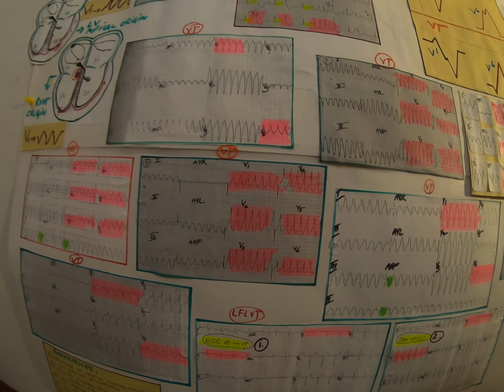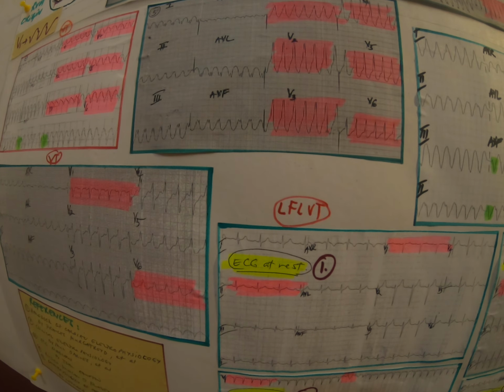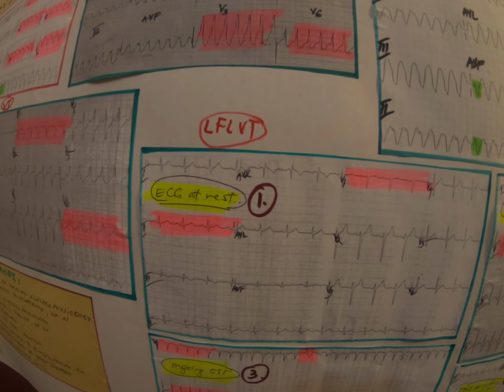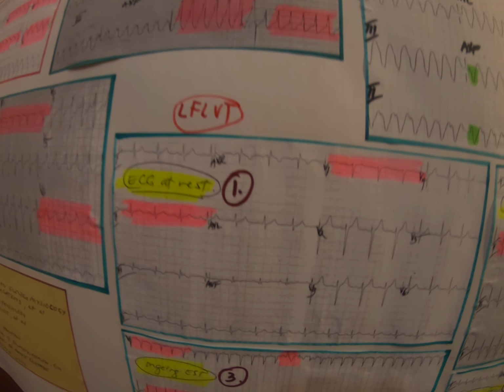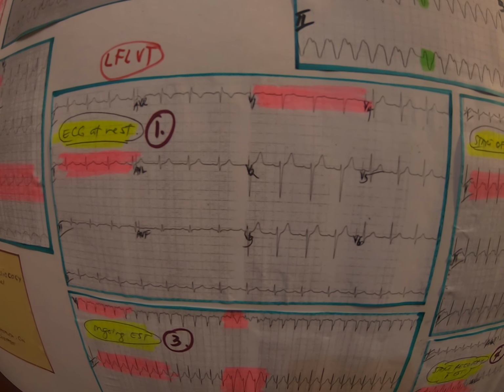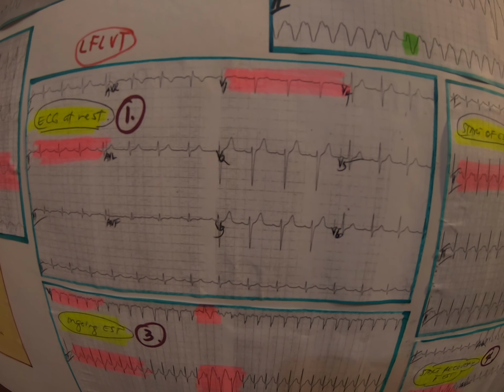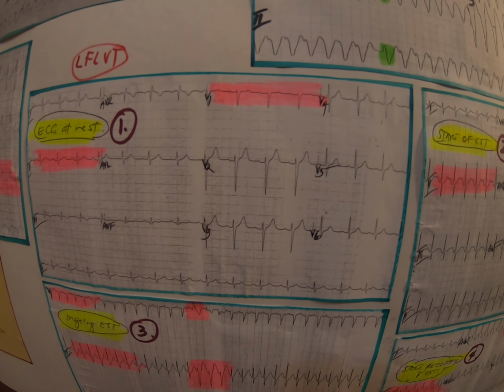Okay. So anyway, the electrophysiology study will be the one to decide and investigate if that is really VTAC or what. Because the patient is awake and just complaining of some palpitation or anything, but the patient never passes out or goes into cardiac arrest or LOC. They're conscious and everything. This is the one I'm talking about. Not all VTAC can crash. Not all people with VTAC can crash. There are some that can tolerate it because it depends on the site of the ventricular tachycardia.